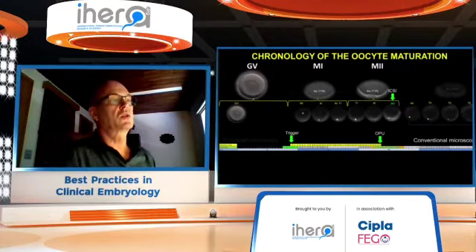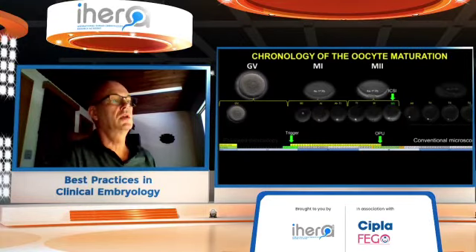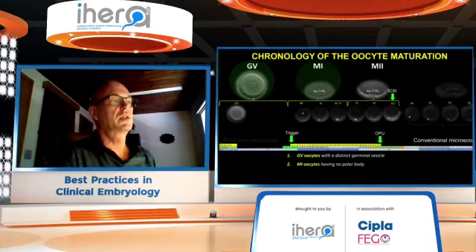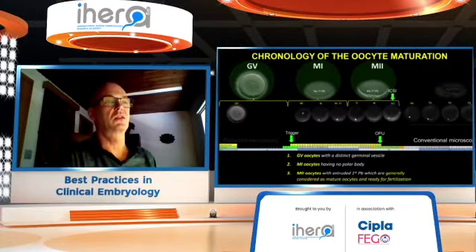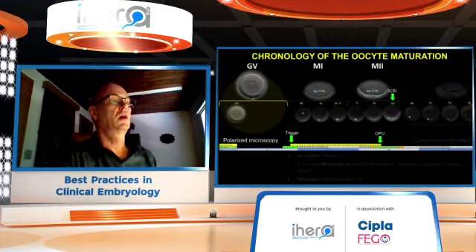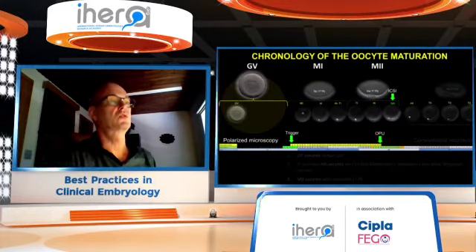Using conventional microscopy, we can distinguish three basic stages of maturity: GV oocytes with a distinct germinal vesicle, M1 oocytes having no polar bodies, and M2 oocytes with an extruded first polar body, which are generally considered mature oocytes and ready for fertilization. However, under polarized microscopy, we can see a slightly different picture.